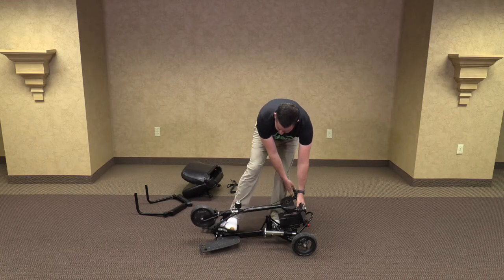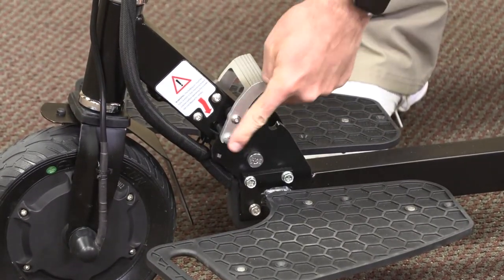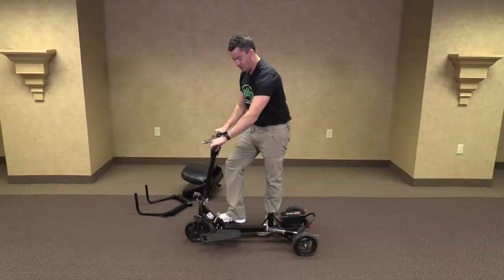Let me show you that one more time. Foot pedal depressed. It clicks into place — making sure that it is locked in place and is sturdy and ready to go.